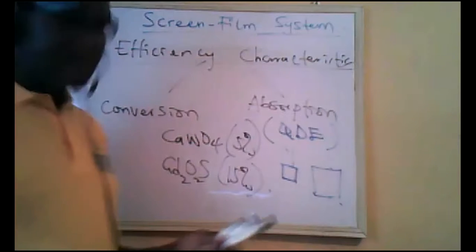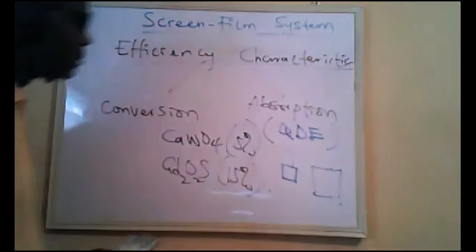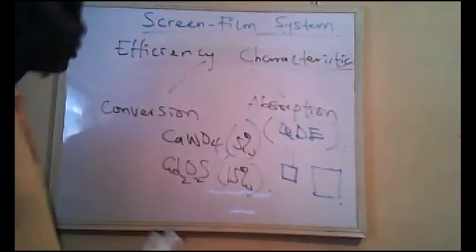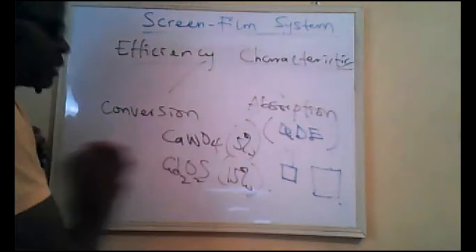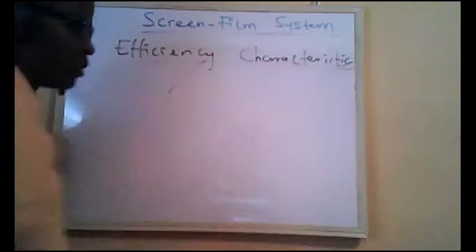But the thing is this: for the two screens, calcium tungstate and gadolinium oxysulfide, this one is better. It has been proven to be better, so it has taken the place of calcium tungstate.